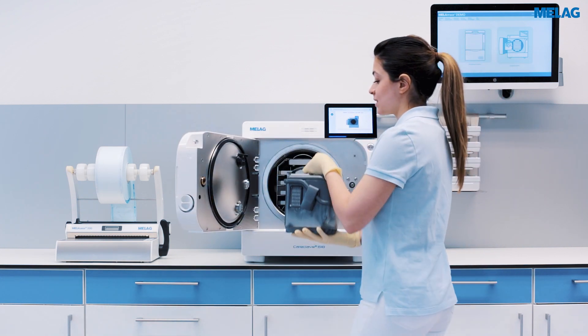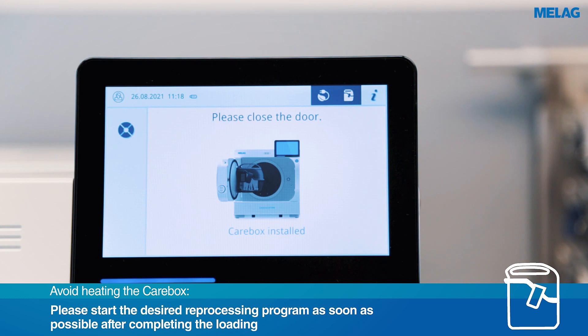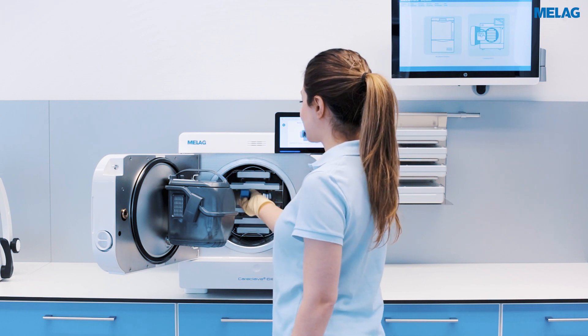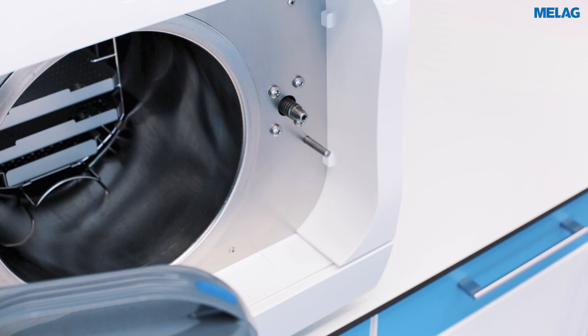Careclave automatically recognises that a Carebox has been inserted and switches to Careclave mode. In addition to cleaning, disinfecting and lubrication of the instruments in the Carebox, you can sterilise additional instruments in the rear area of the chamber by using the CareB combination programme.